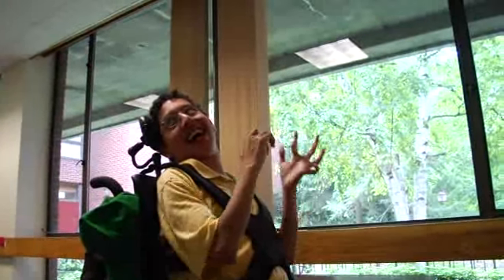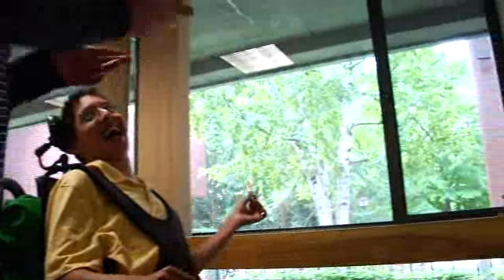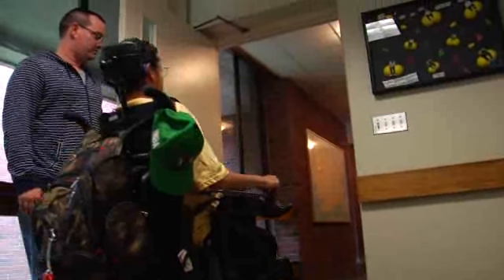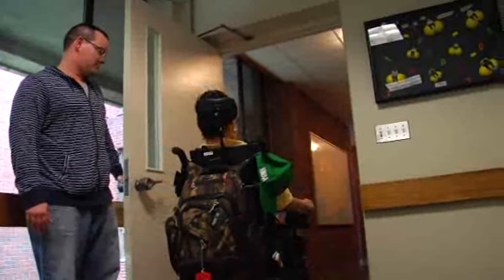handle somehow. In a video clip, a young man drives straight up to a closed door and signs for assistance in opening the door. An instructor steps in to pull the door open, and he signs to the young man, asking him to move back slightly to allow the door to swing open.